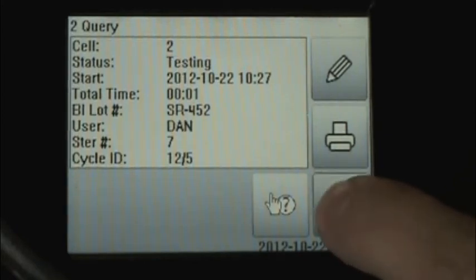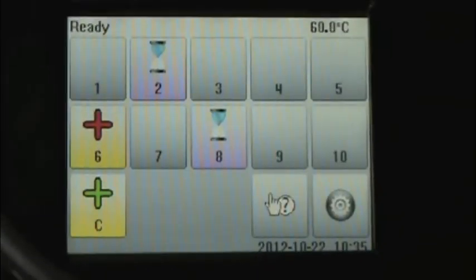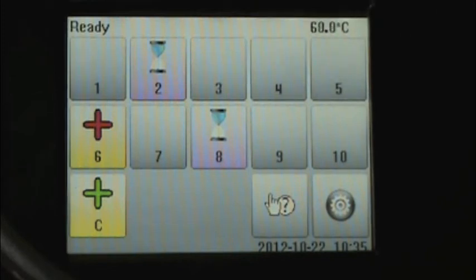Once we've reviewed this and verified that all the information has been entered correctly, we simply click the back arrow and we go back to our home screen. The home screen will show us the status of the various biological indicators that are currently in the incubator. Here, we can see in cell number two the background color is purple, and that designates that the media in that particular biological indicator is also purple at this time. The hourglass tells us that the biological indicator in well number two is currently in test.